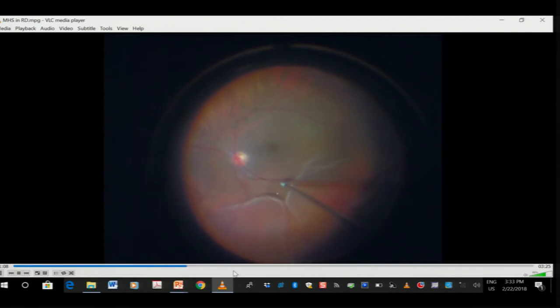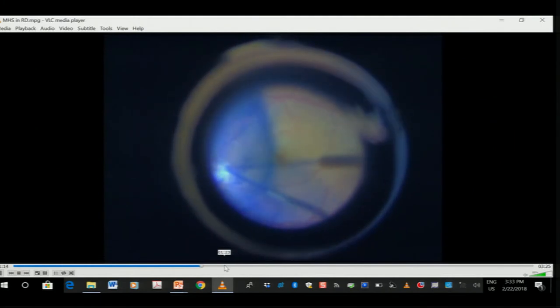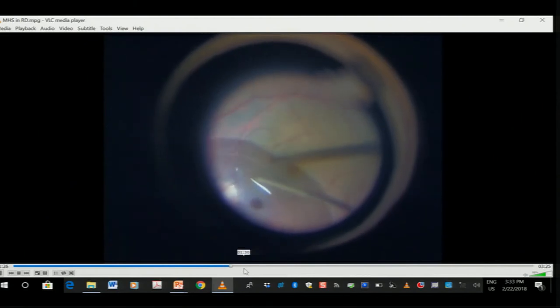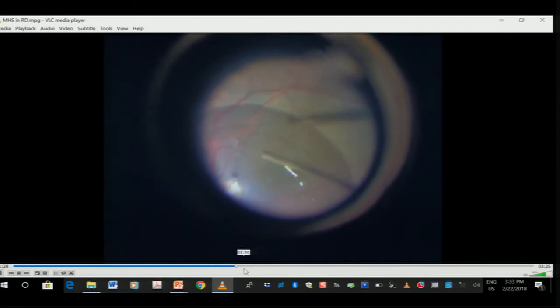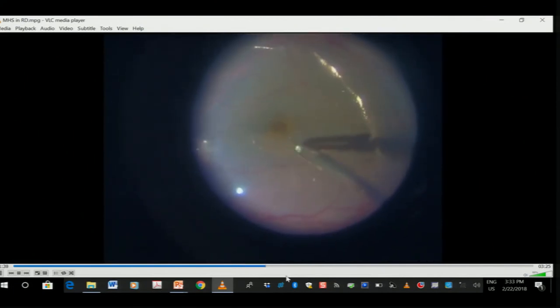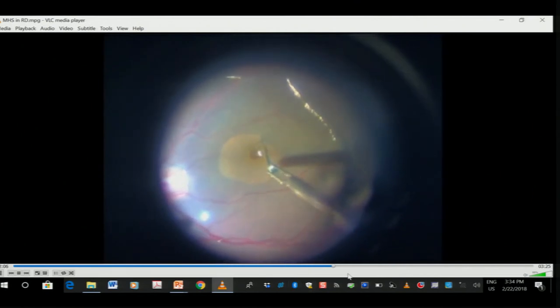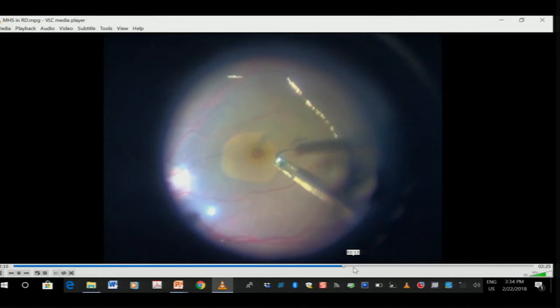Then remove the PFCL and then inject the dye under fluid only. This way, inject BBG dye, and then put PFCL again back and then try to create an edge in the ILM. This was direct pinch technique, no diamond scraper used. And here the ILM peeling becomes slightly atraumatic and you can easily peel. The difference in the feel of surgery is that this ILM tends to get rolled rather than put a flap. So this is what I do normally, that peel ILM under the PFCL rather than direct. Because the pull onto the retina is less, and I believe the photoreceptor, you are unnecessarily pulling them too much if you do without the PFCL.